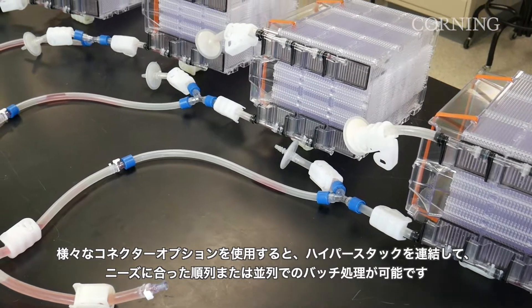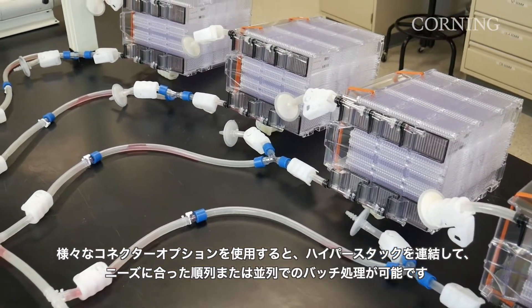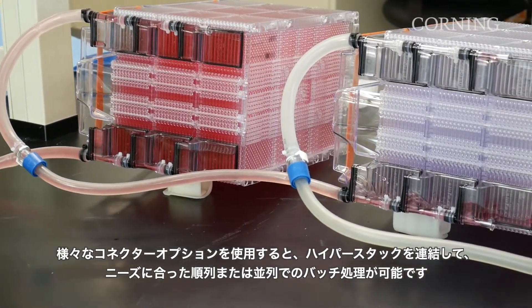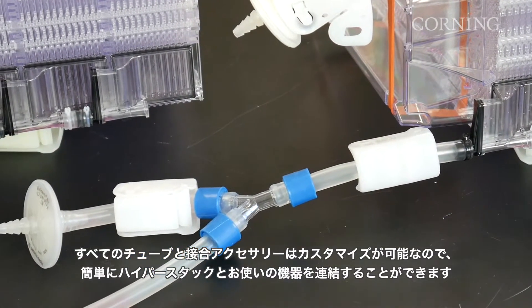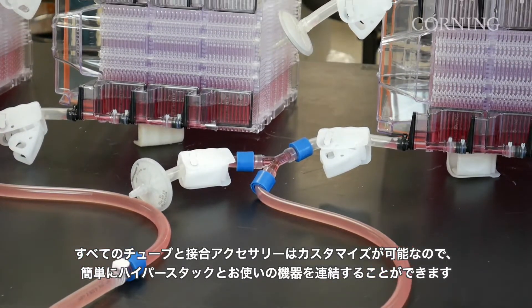With a variety of connector options, you can manifold your HyperStacks to achieve serial or parallel batch processing, whichever meets your needs. All tubing and connector accessories are customizable, so you can easily integrate a manifolded HyperStack system into your existing equipment.